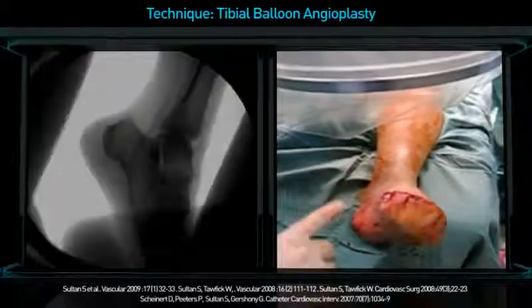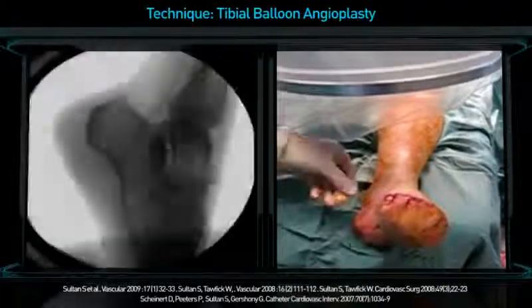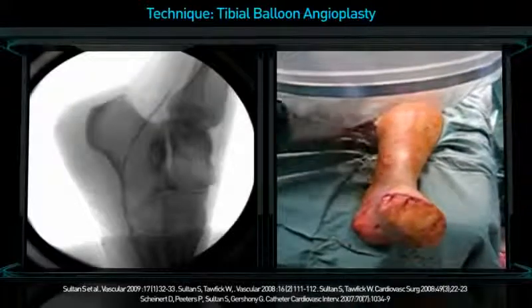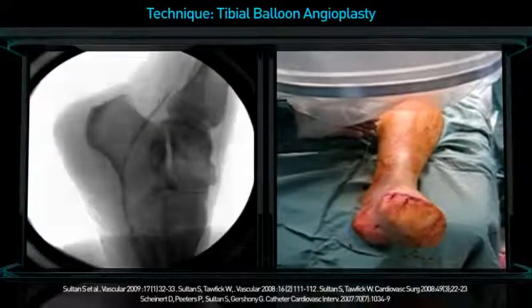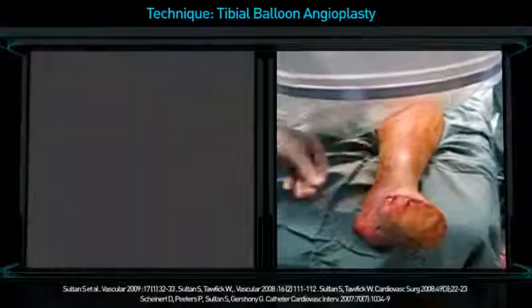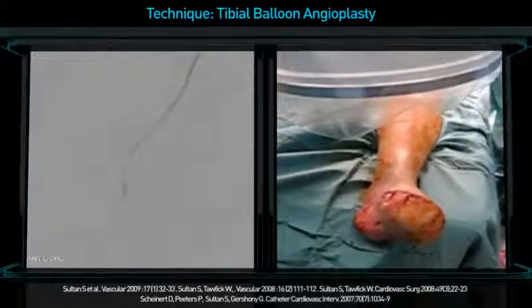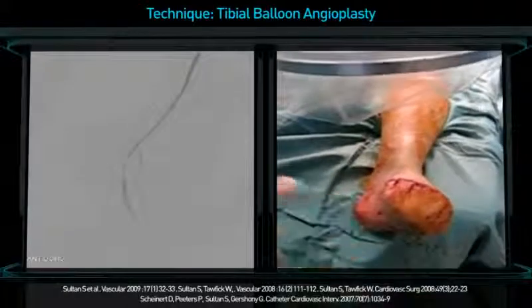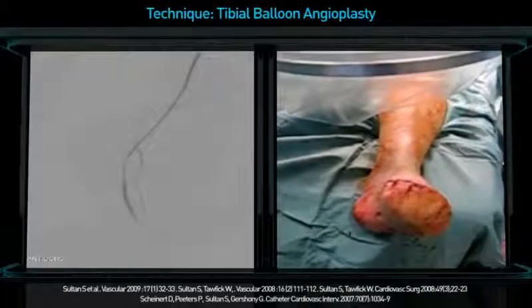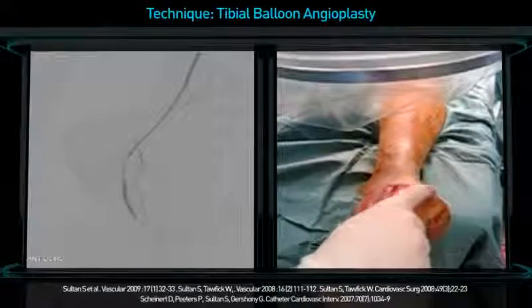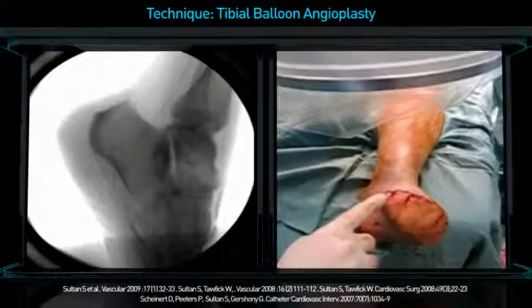We cross from the posterior tibial artery to the dorsalis pedis, creating a pedal arch loop to enhance outflow and heal deep foot ulcers. In some cases, the wire may extend through the TMA to the exterior, making exchange of catheters, balloons, and stents easier to handle.